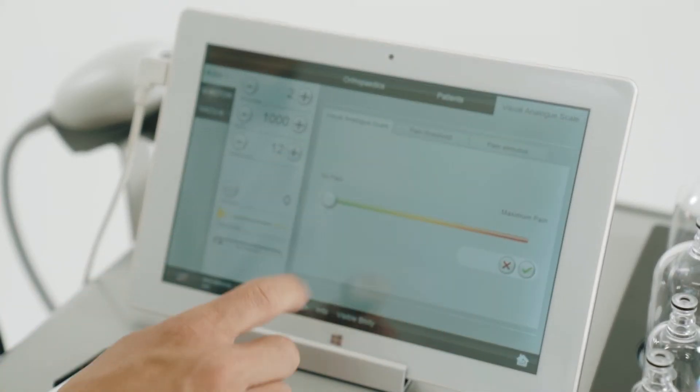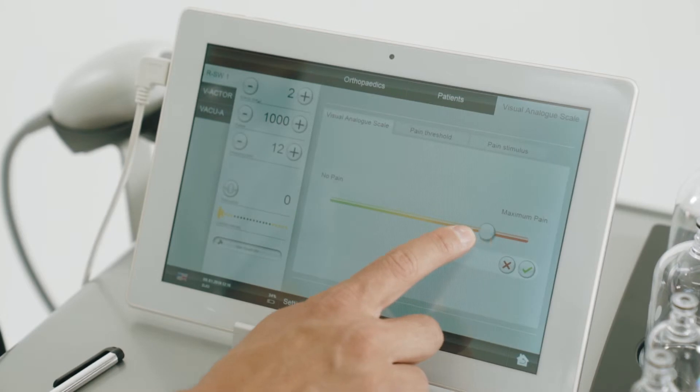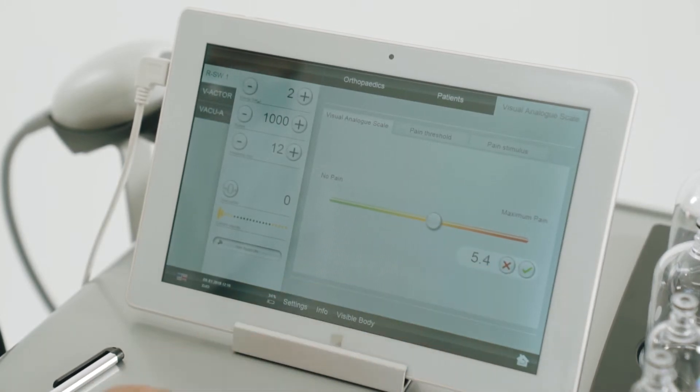Another interesting feature is the visual analog scale, which allows you to measure their pain threshold on day one and compare that to the pain threshold after say three or six treatments. The tablet also comes inbuilt with visible body anatomy software, which is really good for patient education.